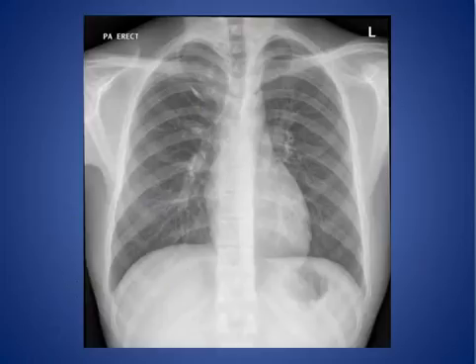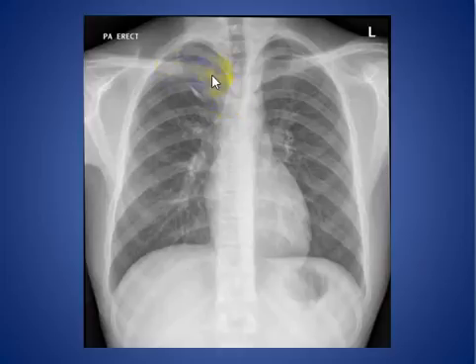In summary, this is a relatively common normal variant. You can see the azygous vein and the azygous fissure on the chest x-ray.